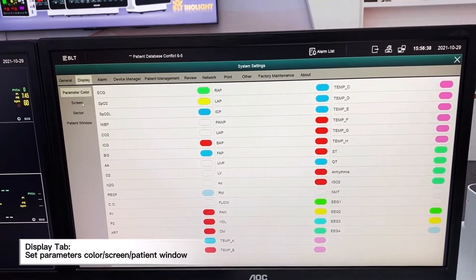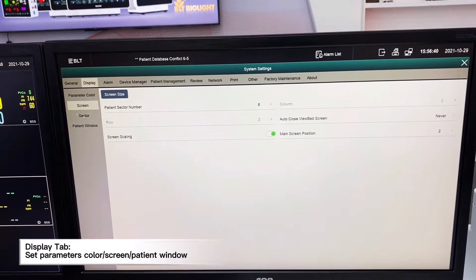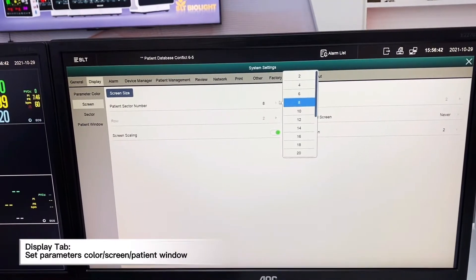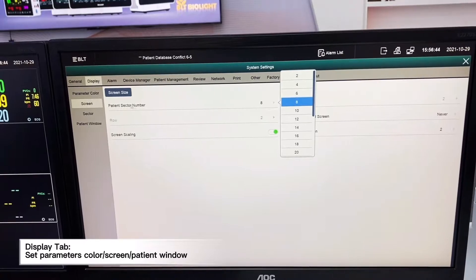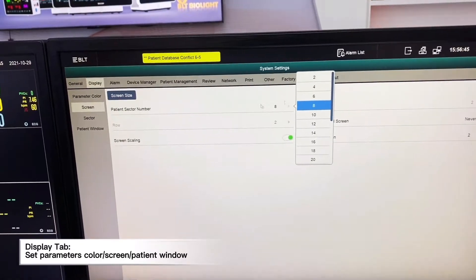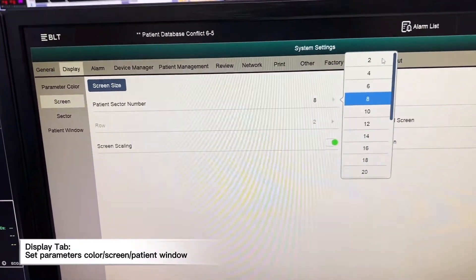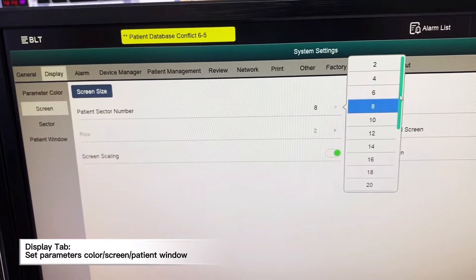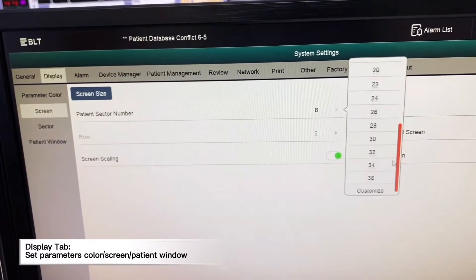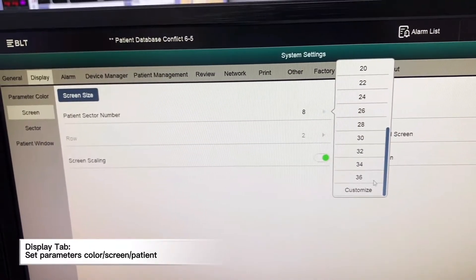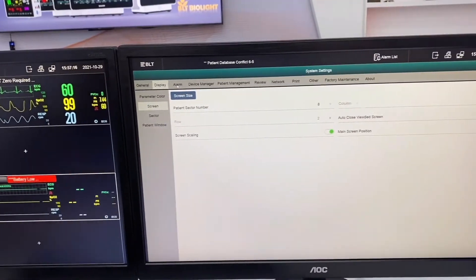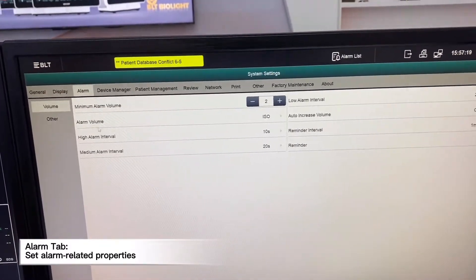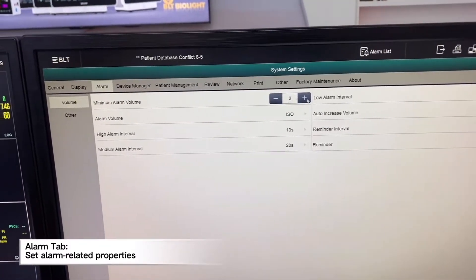If you want to change the display layout, we can select it here. We can also customize alarms. The third option allows us to change the volumes.